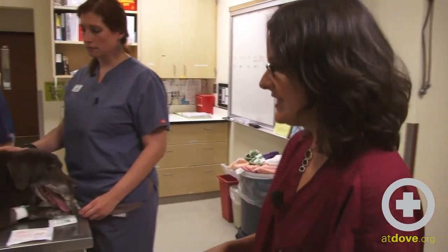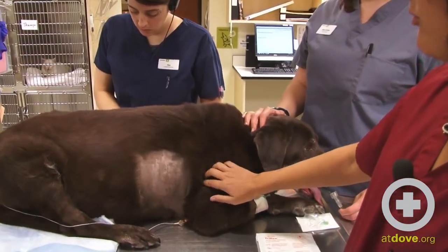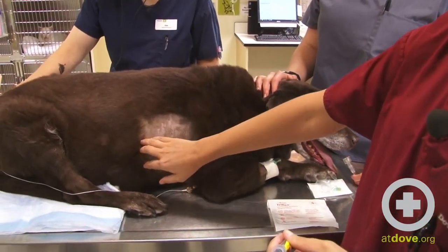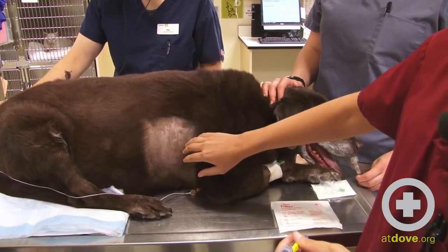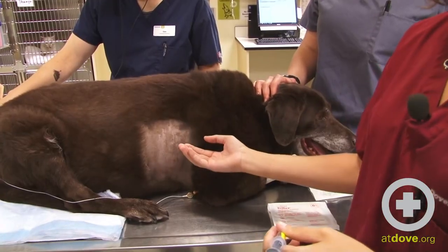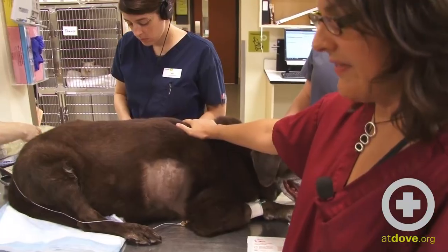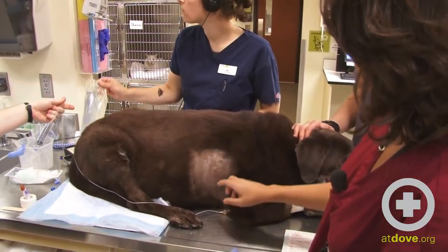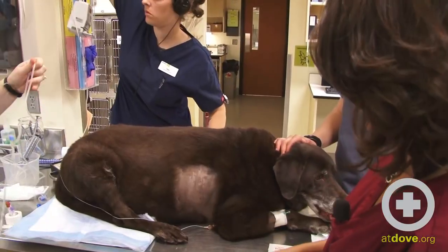So we're going to perform a pericardiocentesis. We've shaved from basically the fourth intercostal space to the eighth to ninth intercostal space. The actual site you're going to go is at the fifth, and this is the right side. You do not want to use the left side as that's where the coronary vessels are, so you risk lacerating those vessels if you perform it on that side. We're going to perform a local block at the site at the fifth intercostal space right now.